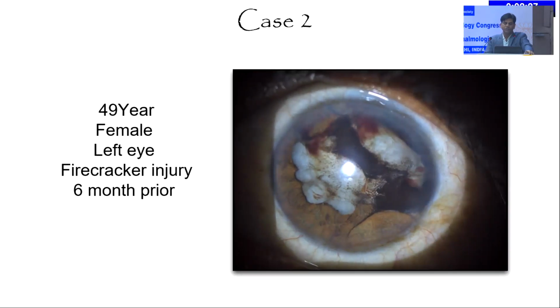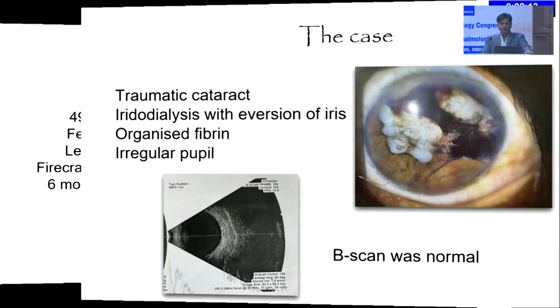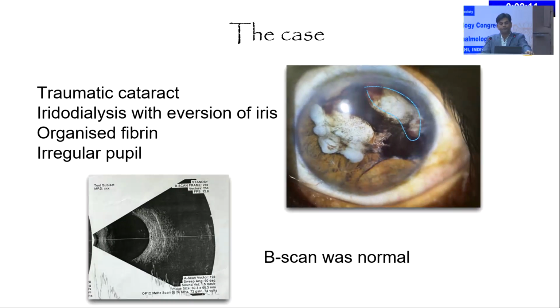This is another case, a 49-year-old female, left eye, after firecracker injury, and unfortunately she presented 6 months after the injury. Here, you can see the traumatic cataract with iridodialysis, and eversion of the iris.